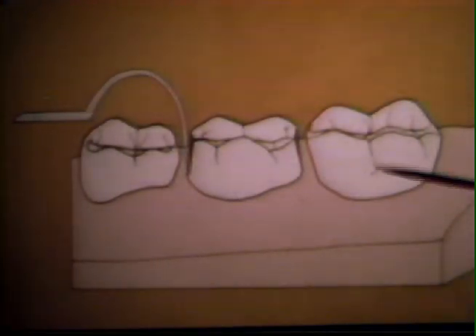This is the tooth we will prepare today. Notice the occlusal convergence of the buccal and lingual surfaces. The prominent occlusal anatomy will require a minimal occlusal reduction and hence add to the retentive factors of this preparation. This is an occlusal view of our molar, showing the slight occlusal convergence of our proximal slices. The amount taken off the mesial distal is just enough to pass a sickle explorer, as this slide shows.